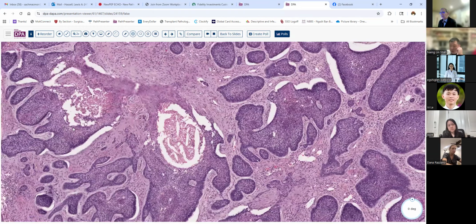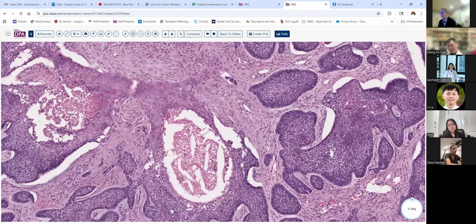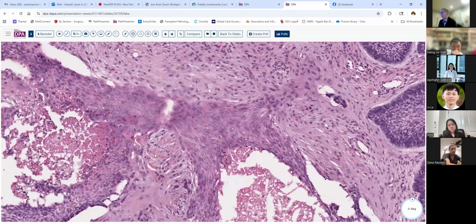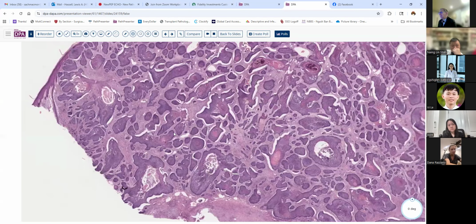So if your biopsy were just of an area like this, where the cells are maybe a little bit more spindly, there's some obscuring of the border here, you might have difficulty, if you were just looking at this one high power field, to call it a basal cell carcinoma without more evidence or more awareness of the cleft, for example.